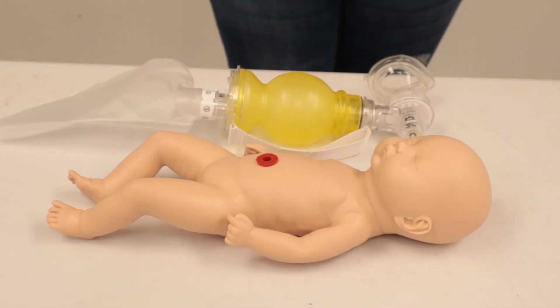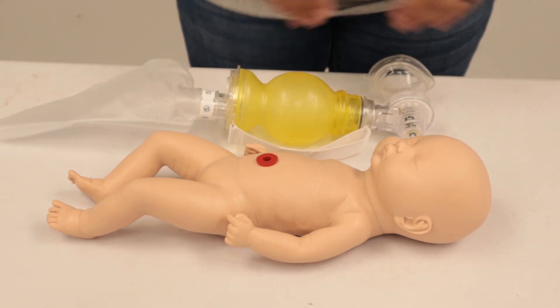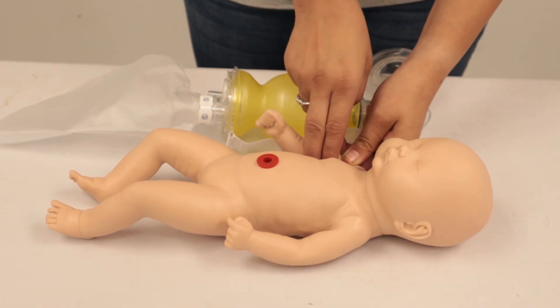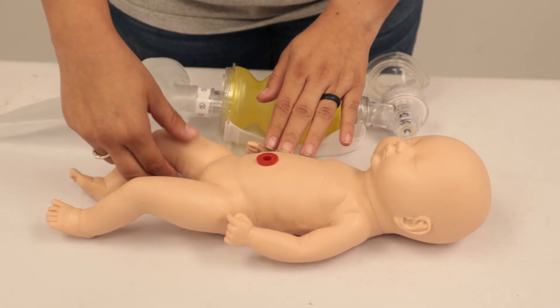For neonate resuscitation, BSI and scene safety first - I have my gloves on. We're going to be checking the neonate for either gasping or a pulse rate. We will palpate here at the brachial artery or down here at the femoral artery in the legs.